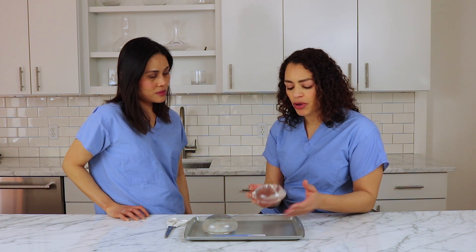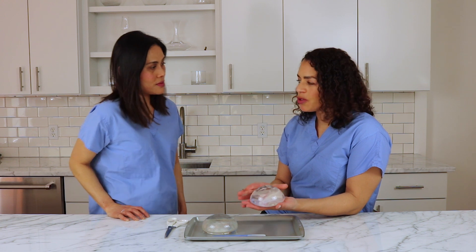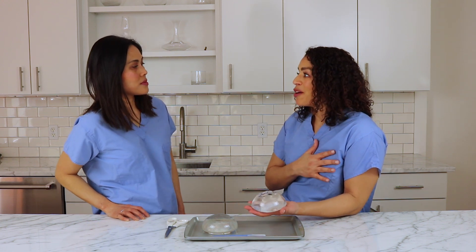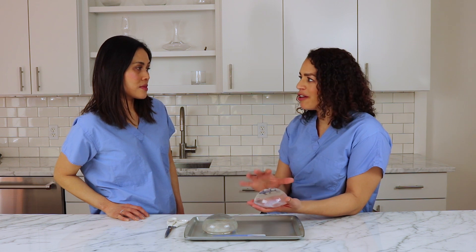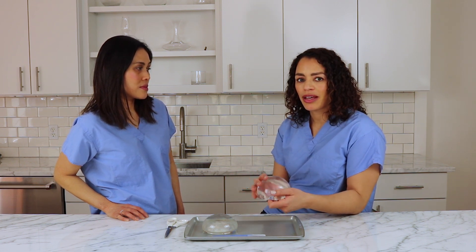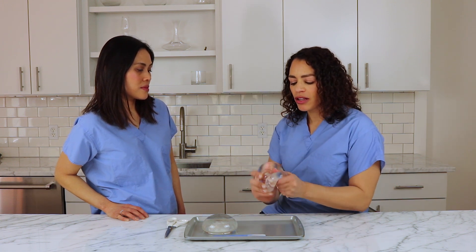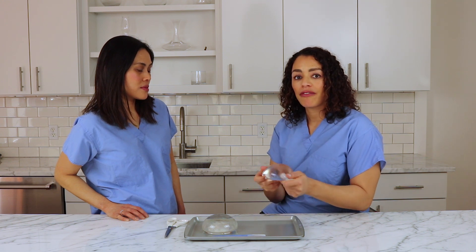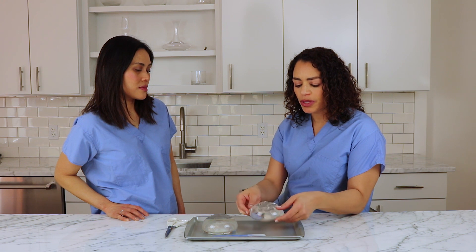I think it's also important to know that I have a lot of patients who kind of protect their breasts after they've had breast implants — they're afraid of breaking them. You can sleep on your stomach if you have breast implants, and the implants can withstand a fair amount of trauma before they rupture, so you can go on and live your daily life without always being worried.